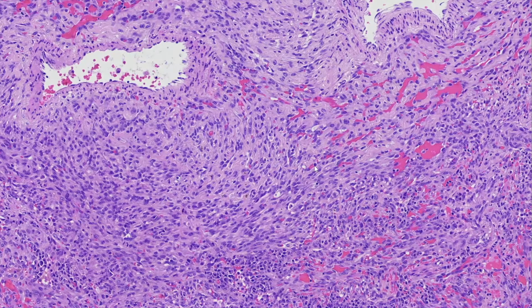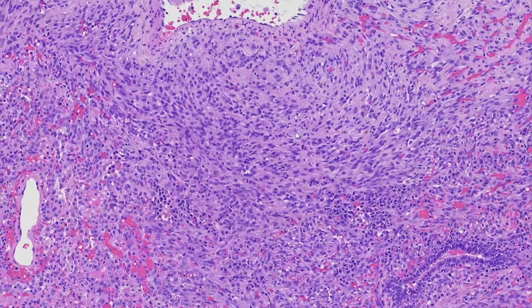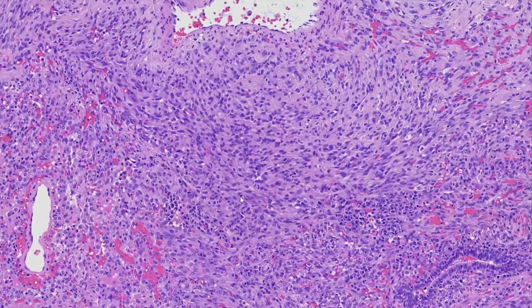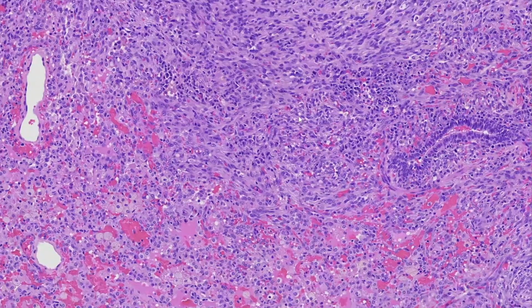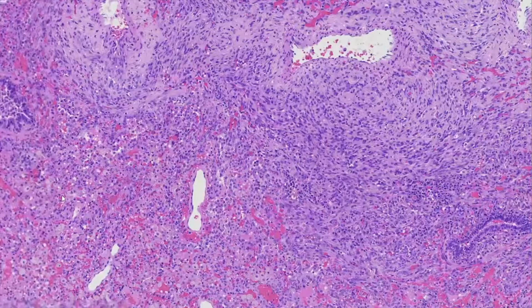And an important vascular lesion in the lung is actually a Kaposi sarcoma, which typically has this relatively monotonous proliferation of these spindle cells in these fascicles. We see these complex vascular channels. We often see extravasated red blood cells and intracytoplasmic lumina formation. And then we can confirm this diagnosis with an immunohistochemical stain.